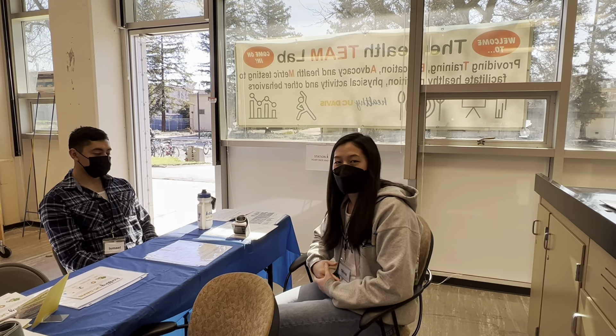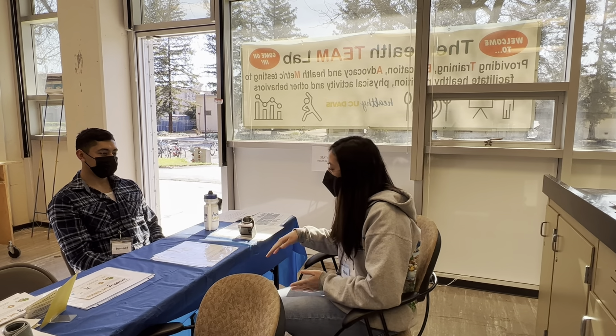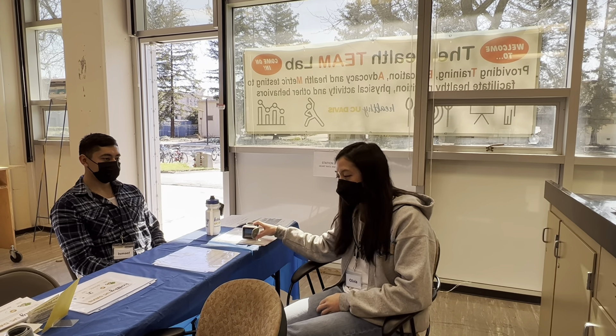Good morning, my name is Olivia and I will be walking you through this station where we measure the participant's heart rate.